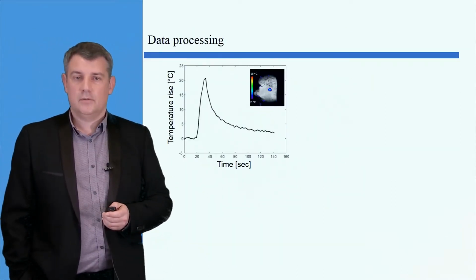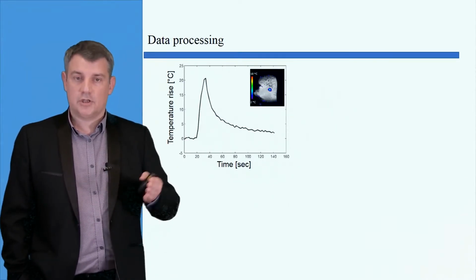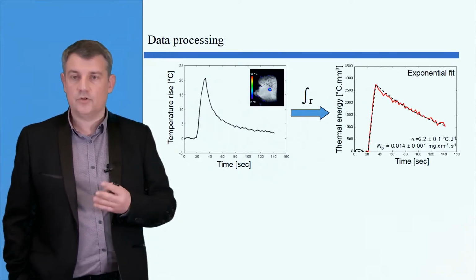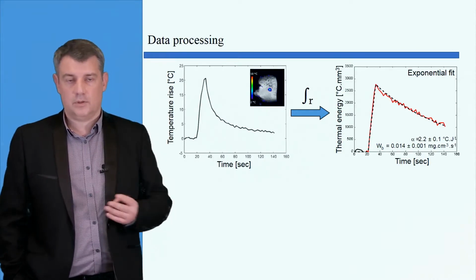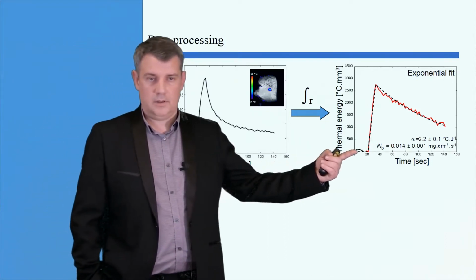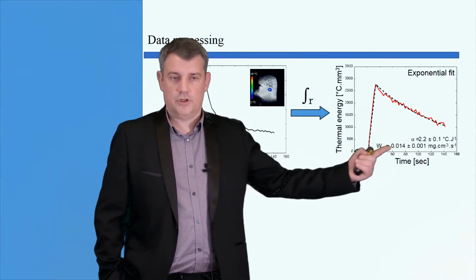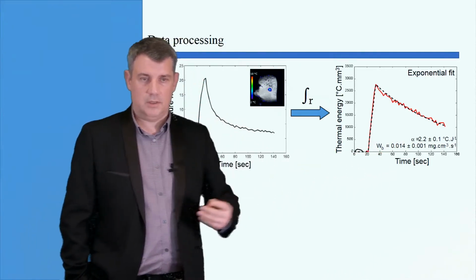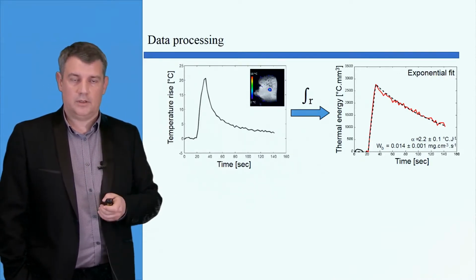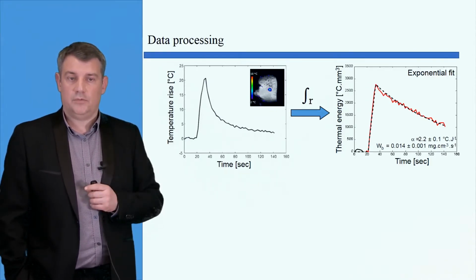Okay, since we have multi-slice images, you can, for example, integrate in space at each time point of the measurement the temperature distribution. If you do that, the diffusion has no effect on the curve that you are obtaining. And then you can show that this curve on the right only depends on the absorption coefficient and the perfusion coefficient. And if you fit this data to a model that you can derive from the equation I've shown before, you can retrieve the absorption and perfusion parameters.